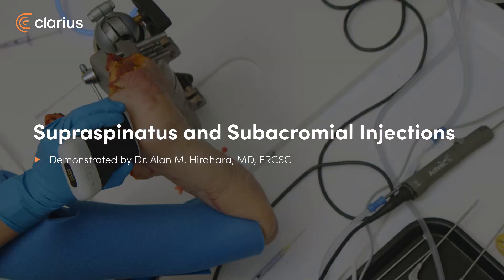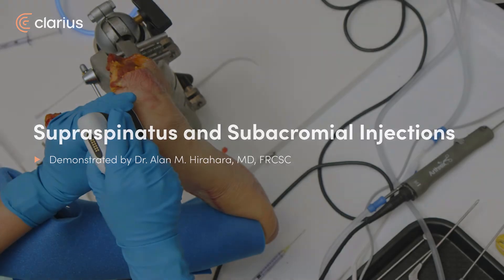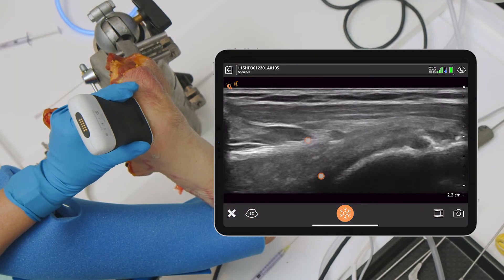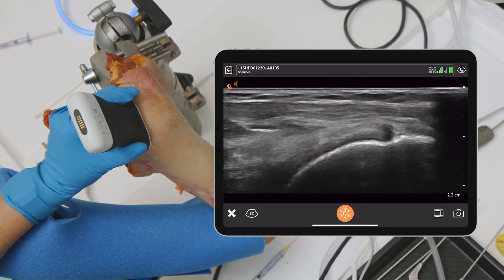Looking at the supraspinatus, we can see it here. We want to come posterior enough to be able to see it nicely, and you can see it really well there. You can see this patient actually looks like he possibly has a partial tear of his cuff — it's not looking great there.